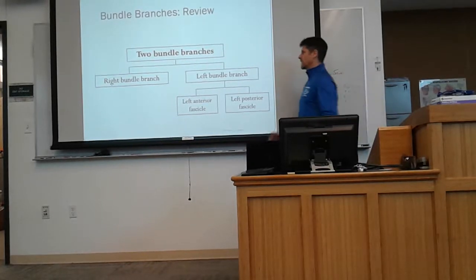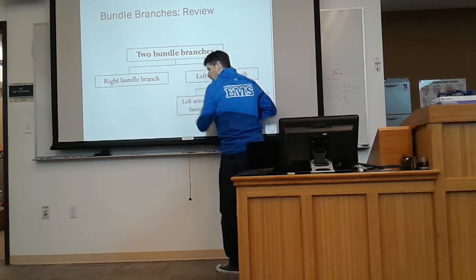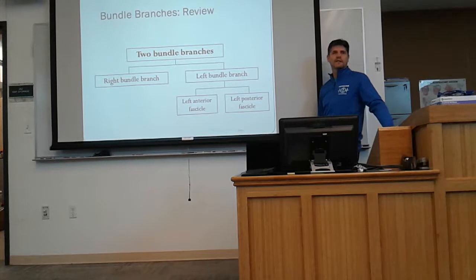Good? And then of course if it's a full left bundle branch block, meaning it took out all of the fascicles on top of that, it's even that much larger in terms of an event that's occurring for that patient. Good?